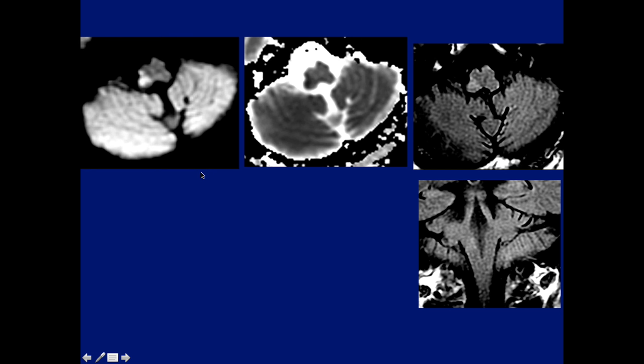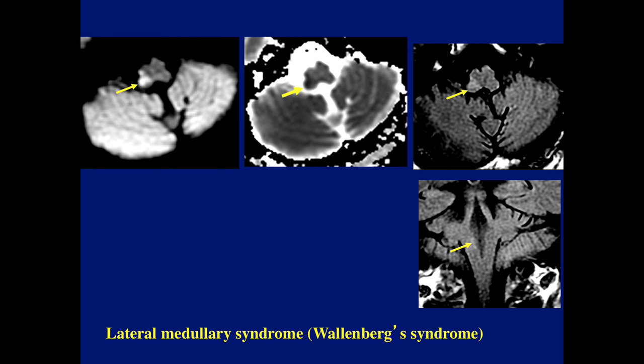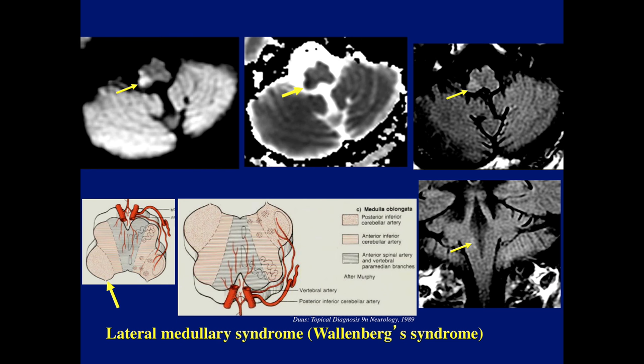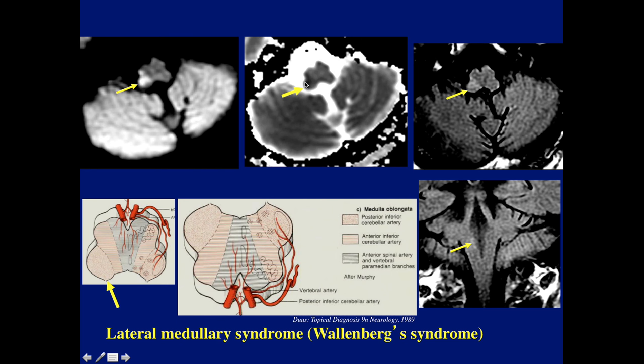Here's a patient showing a stroke in the lateral aspect of the medulla, a little bit posterior as seen on FLAIR. This is the lateral medullary syndrome, or Wallenberg syndrome. At the level of the medulla, this is the territory supplied by the posterior inferior cerebellar artery — the PICA. Classically, when you have a PICA occlusion, you end up with the lateral medullary syndrome.